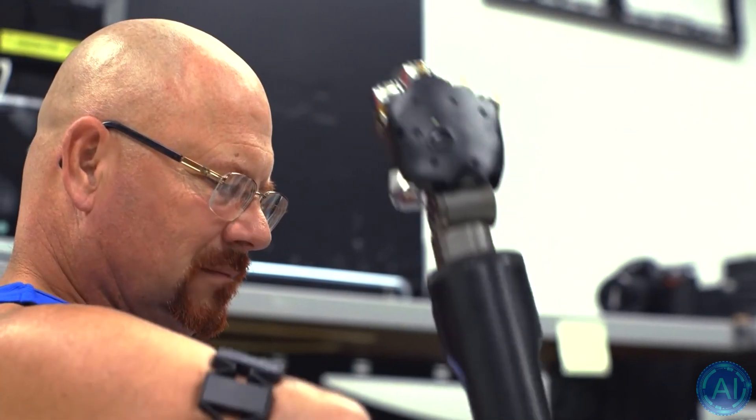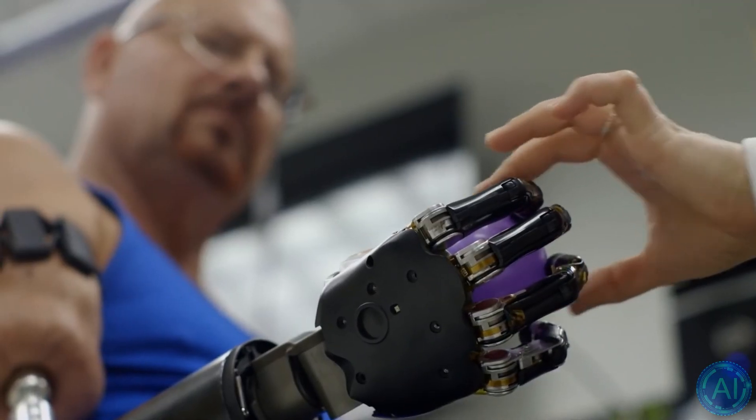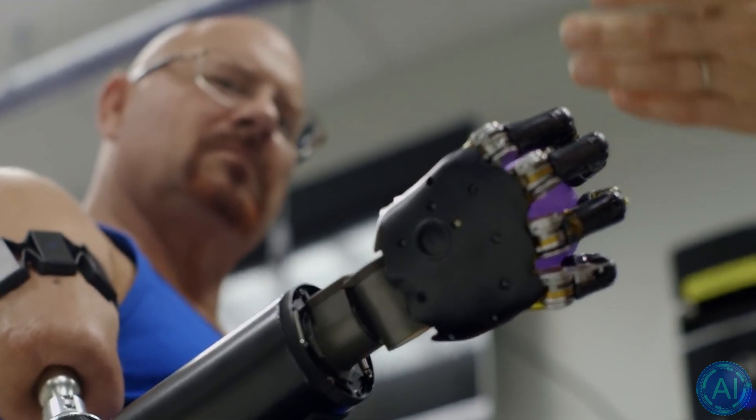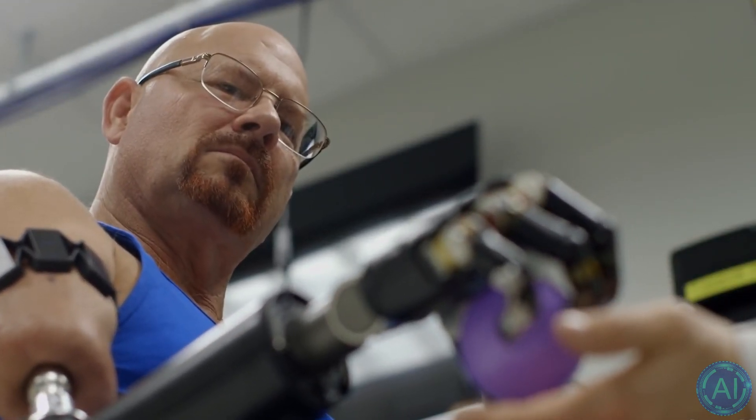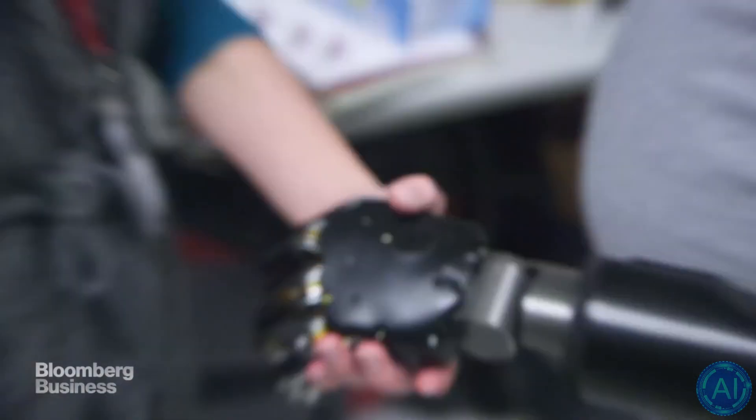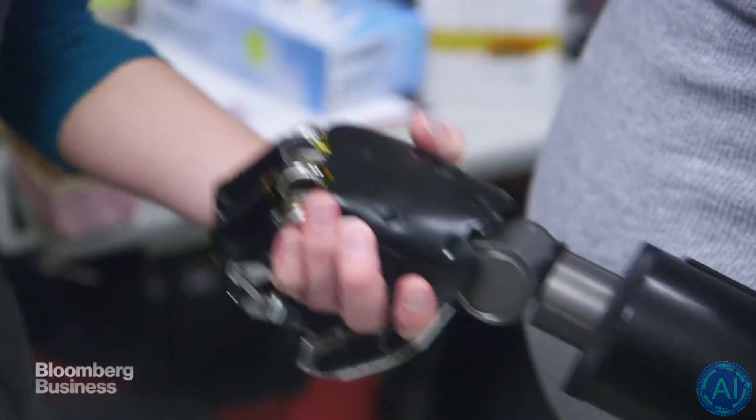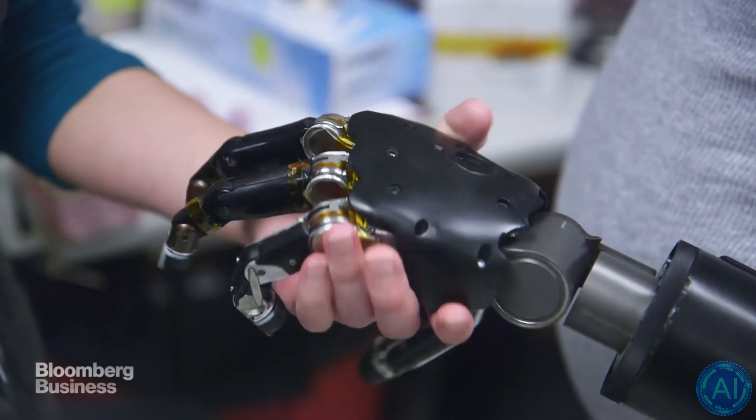Similar to the previous studies, he had to have an additional surgery to rearrange the nerves in his upper arm to allow for the prosthetic limb to be controlled. Johnny mentioned how hard it was to get used to this new way of controlling his arm, but the research facility mentioned future work where signals will be sent back into his body so that he can feel things like texture, heat or softness. In the future amputees will no longer have to get used to robotic arms. The robotic arms will get used to the human controlling it.